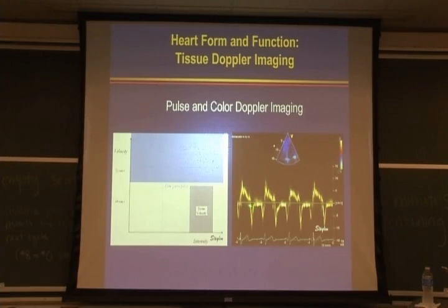And then during diastole, during very early suction of the blood towards the left ventricle, this is a rapid myocardial velocity during early diastole, and then there is a late myocardial velocity during late diastole, and we can measure all this. This has now been used in the clinical arena for several years, and it's a very robust method of measuring myocardial velocity.